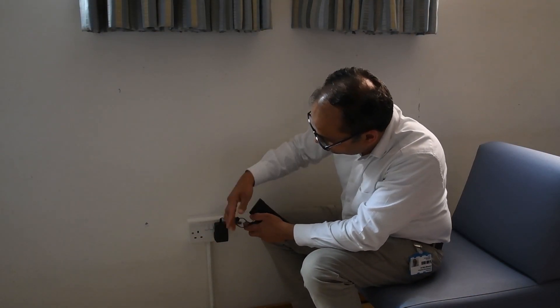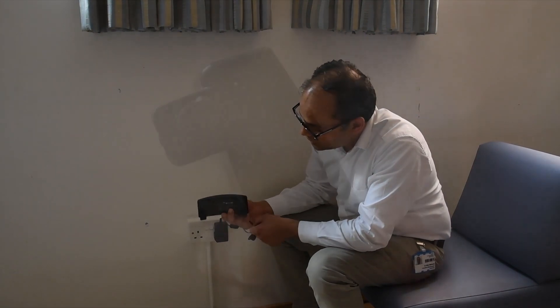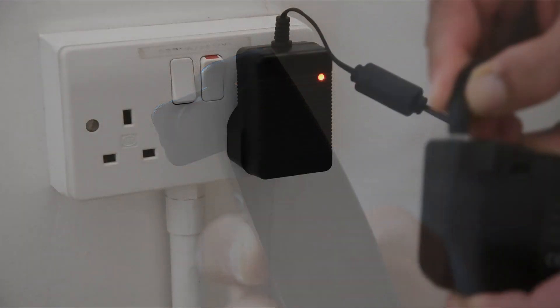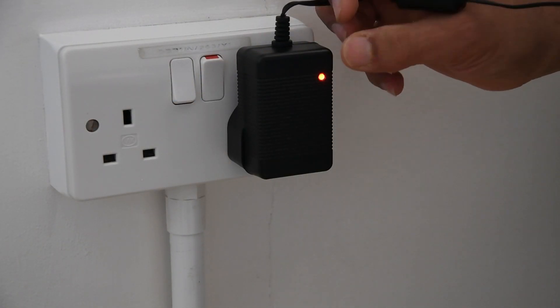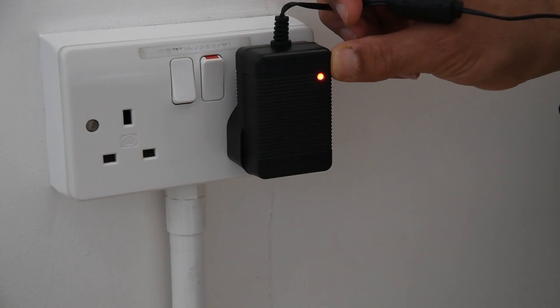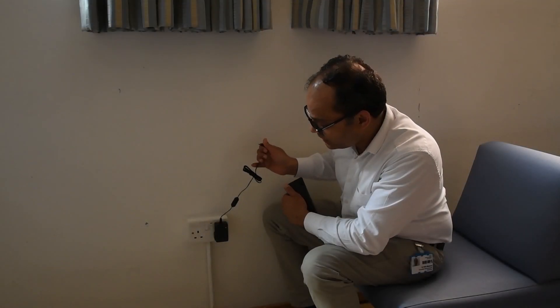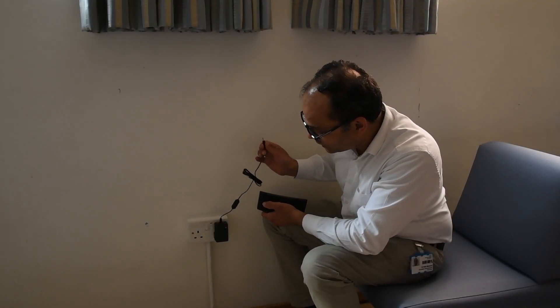This is the charger and this is the battery pack, and the battery pack has a charging pin here. The red light indicates the battery pack is charging, and when it's fully charged the light becomes green. It takes up to three and a half hours for a full charge.